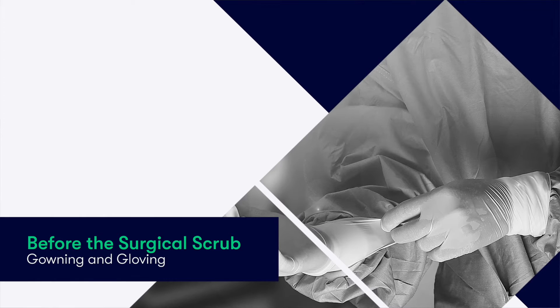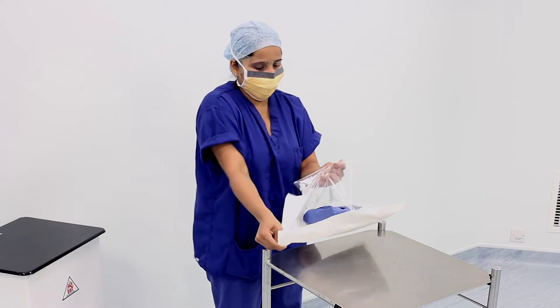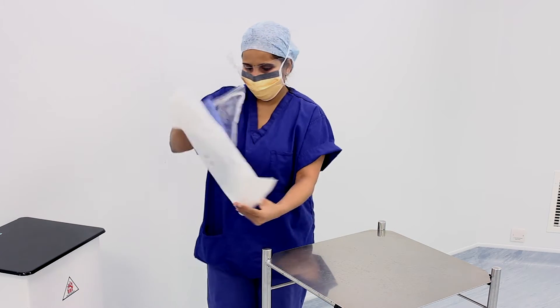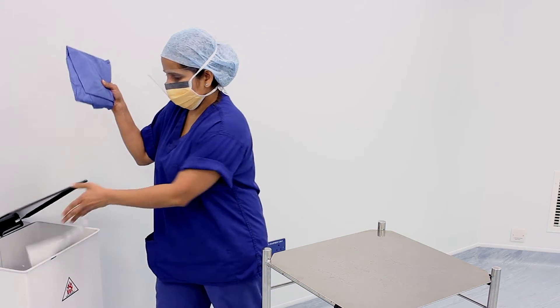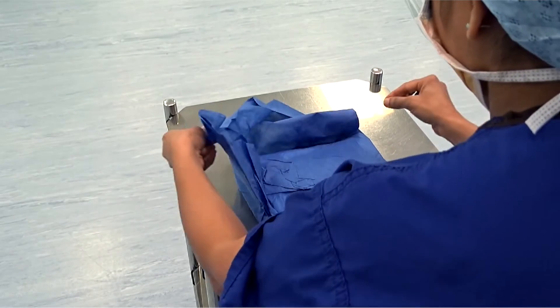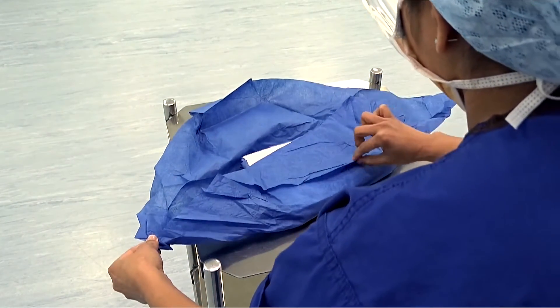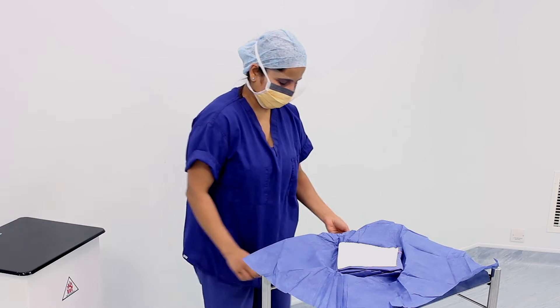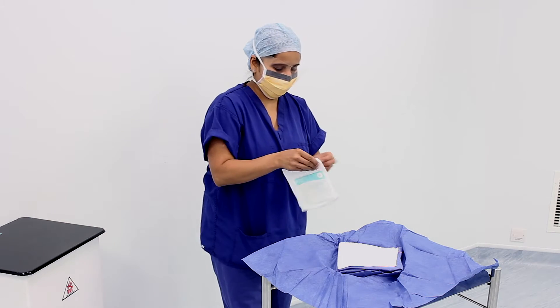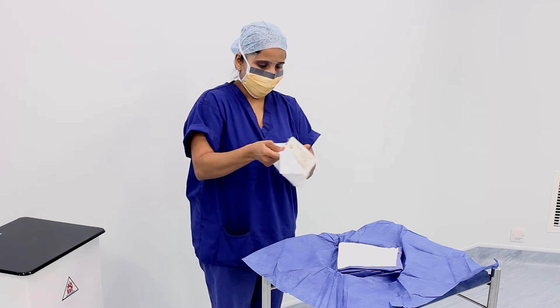Before gowning and gloving, we first undertake a surgical scrub to decontaminate our hands and forearms. However, before going to scrub, we have to first open the pack containing our sterile gown. After removing and discarding the protective cover, we lay the pack upon a flat surface and carefully unfold the four corners to reveal the sterile gown inside. We can then open the pack containing our sterile gloves and allow them to fall gently upon the sterile field.